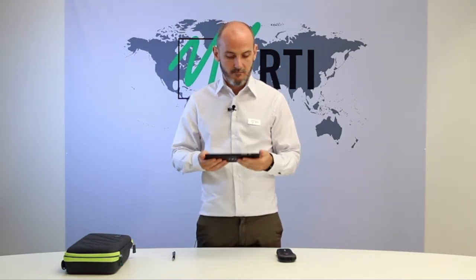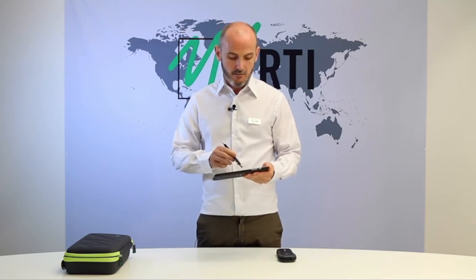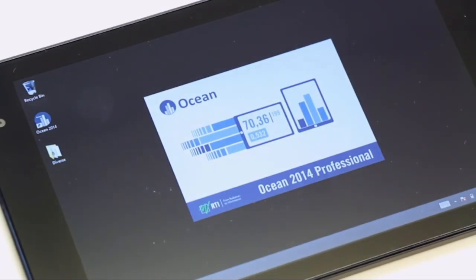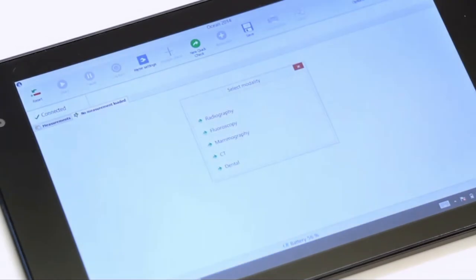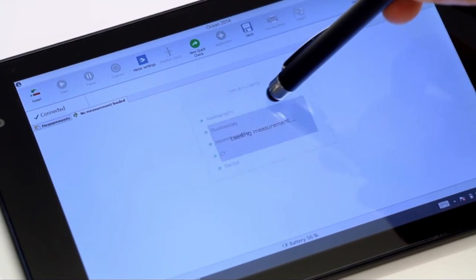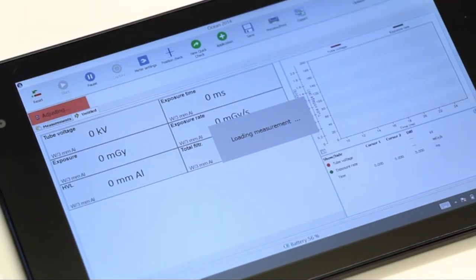To start your first measurement, simply switch on your Piranha, switch on the tablet and start Ocean 2014 by tapping the icon. Ocean will now automatically connect to your Piranha, recognise the model and suggest the appropriate settings for your possible measurements. Simply tap your preferred settings and begin measuring.